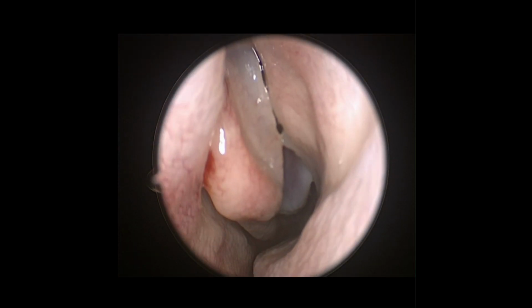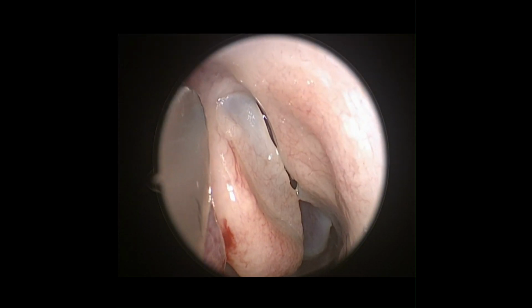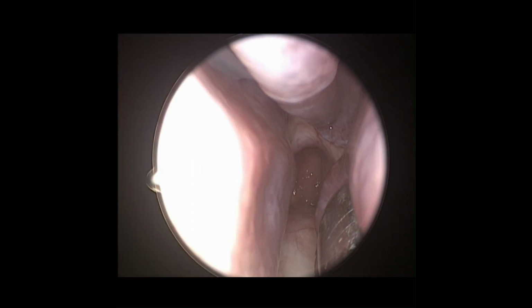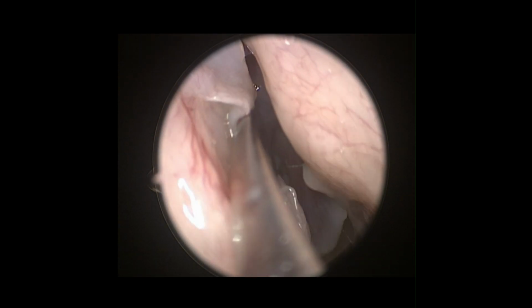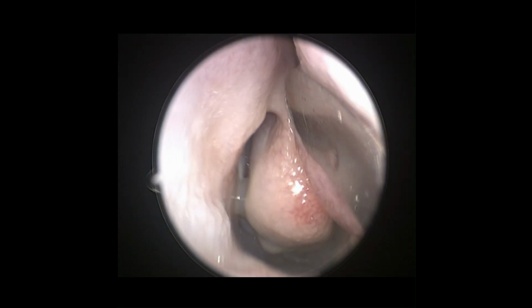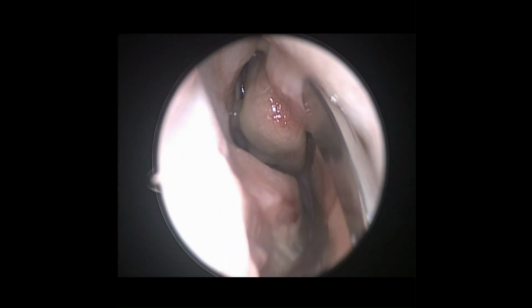In this video, I am going to show the middle meatal antrostomy, which is the initial step of functional endoscopic sinus surgery. Thorough knowledge of CT PNS anatomy and its variations in all planes is the key to safe and successful sinus surgery. The first step is that the middle turbinate is gently medialized with a septal elevator to create space for instrumentation and better visualization.